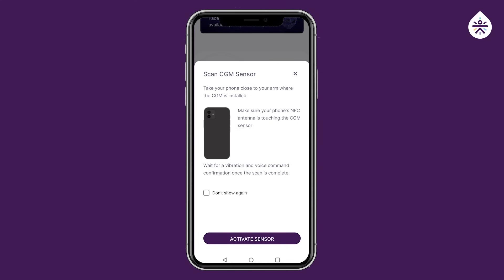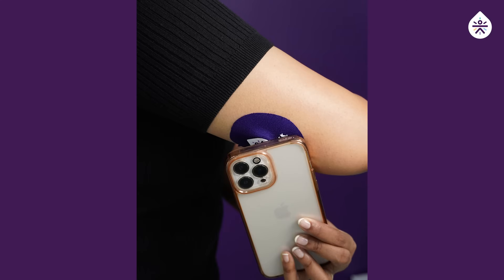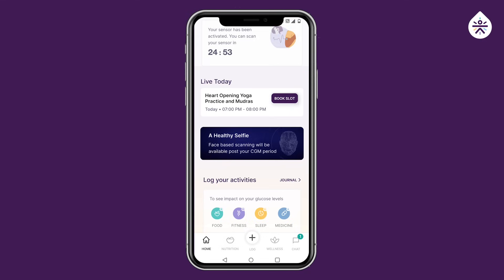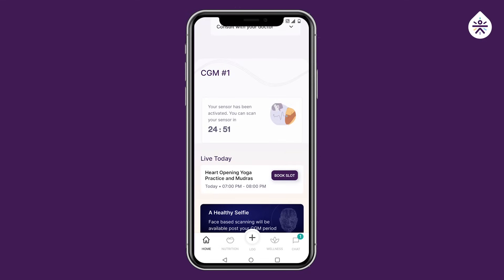Now take your phone near the sensor till you hear either the beep sound or till you feel the vibration. Sensor activated. Your sensor is now activated and will be ready to scan in the next 25 minutes.